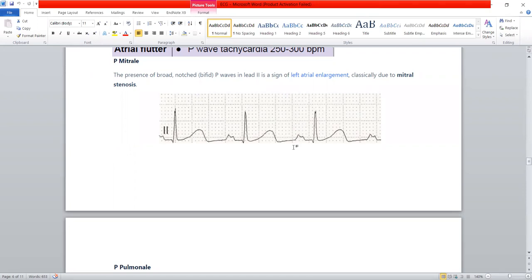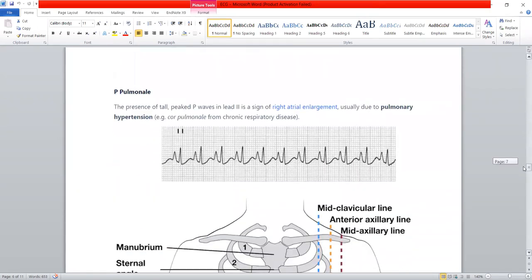So now we know four pathologies of P wave: absent P wave, which is atrial fibrillation; sawtooth P waves, which is atrial flutter; tall or peaked P waves called P pulmonale, indicating right atrial enlargement; and bifid or split P waves called P mitral, indicating left atrial enlargement. Left atrial enlargement occurs in mitral stenosis — that's why this wave is called P mitral.